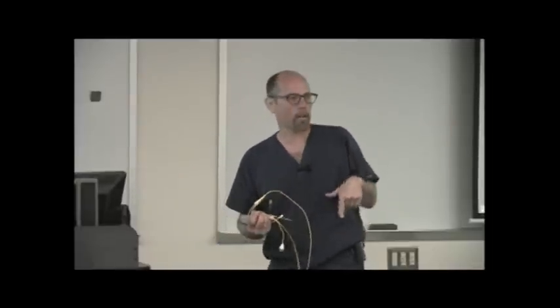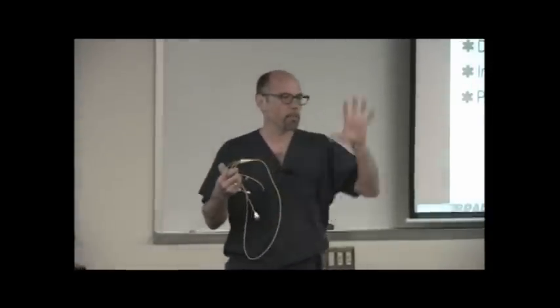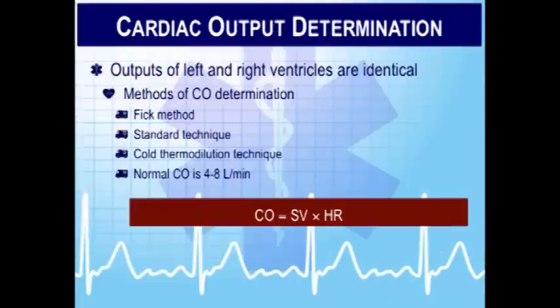You're probably not going to be shooting cardiac outputs in transport. You're just going to want to know what it was before you left. Most of the transport monitors do not have the capability of doing what I described to you. That's going to happen in the ICU. But that's what we do with it.